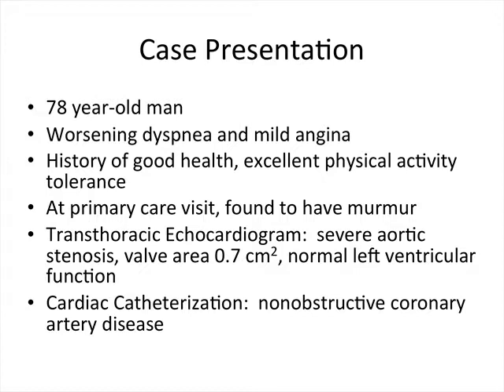A transthoracic echocardiogram showed a preserved ejection fraction, but severe aortic stenosis with an aortic valve area of 0.7 centimeters squared, and a cardiac catheterization revealed non-obstructive coronary artery disease. He is coming to the operating room for an aortic valve replacement.